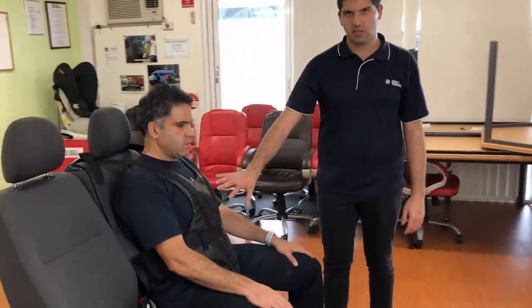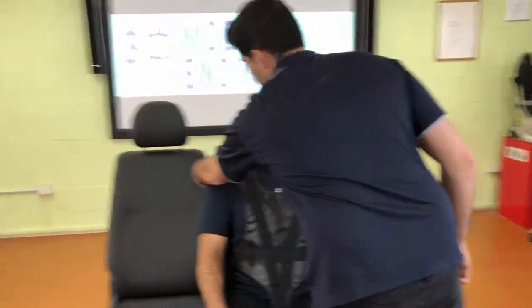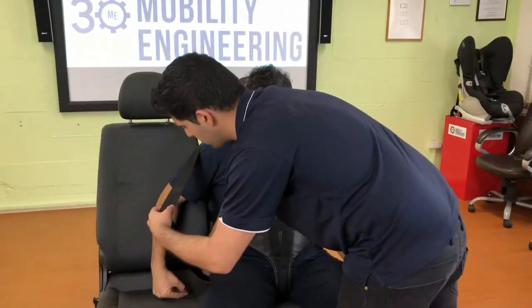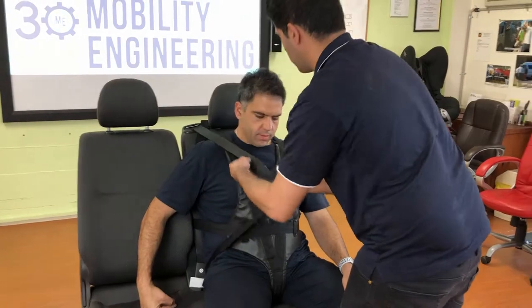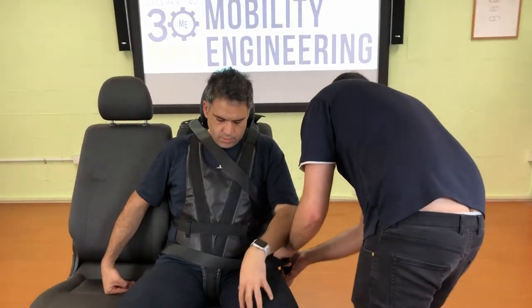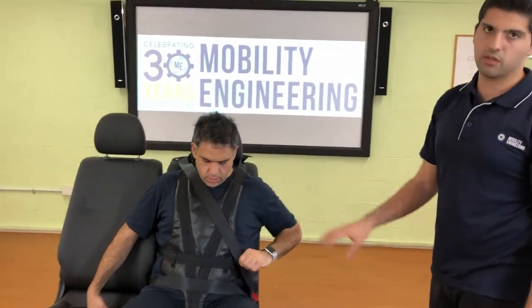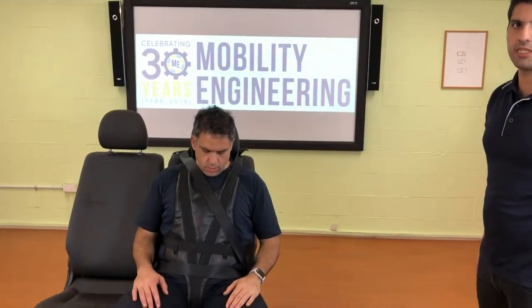Now we've got the harness installed onto the seat. The last part is the seat belt over the occupant. As you can see from the front, the harness is on the occupant — secure, five-point — and then we bring the seat belt around the client, click it in, and the harness is now completely secured to both the client and the seat.